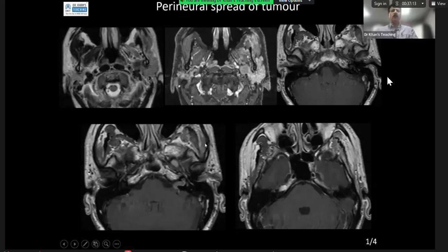This patient came to our hospital since 2 years with facial nerve paralysis on the left side. The imaging which was done was CT temporal bone. Many a times MR was done by the neurologist. But the key point which everybody forgot is that adequate imaging was not done. Parotid, because parotid lesions can also cause facial nerve paralysis.